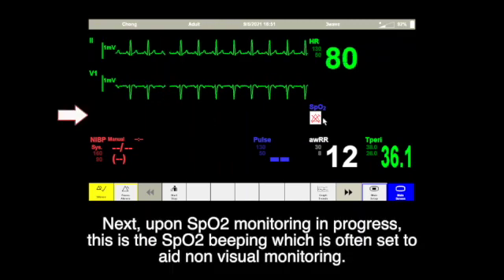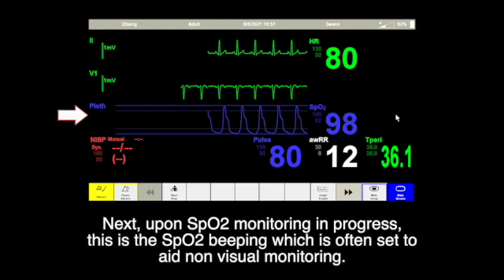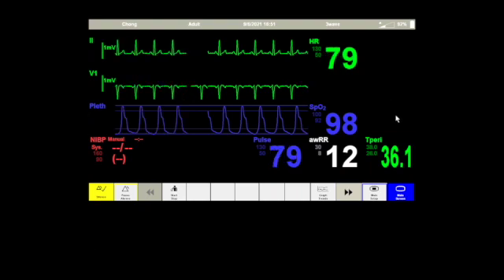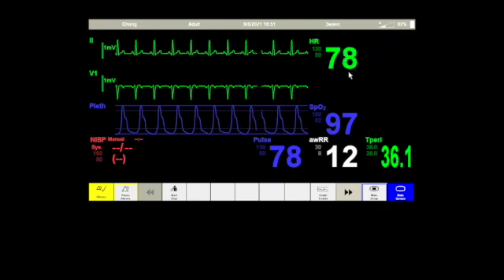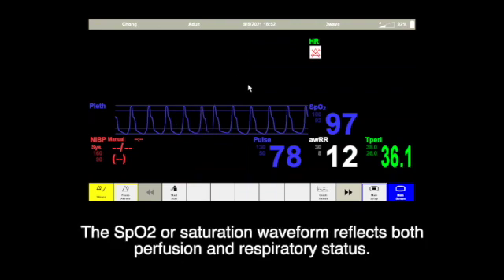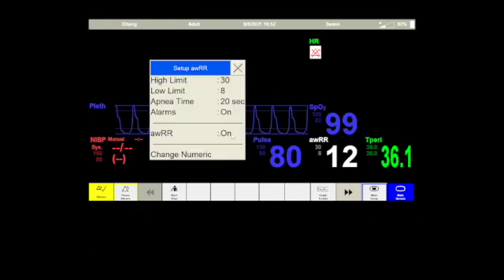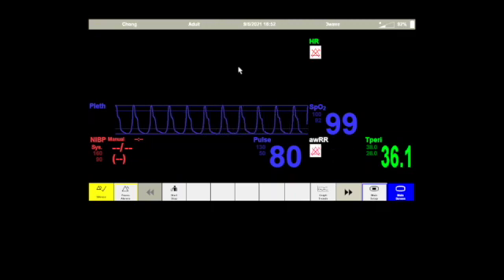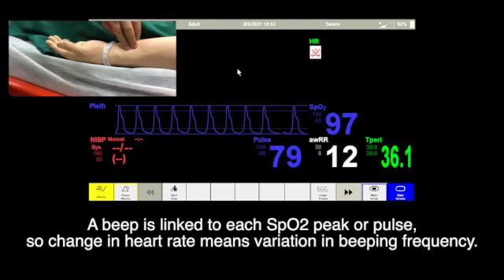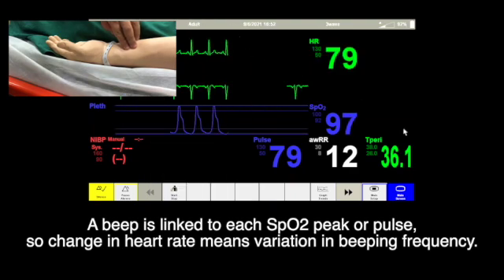Next, upon SPO2 monitoring in progress, this is the SPO2 beeping which is often set to aid non-visual monitoring. The SPO2 or saturation waveform reflects both perfusion and respiratory status. A pip is linked to each SPO2 peak or pulse, so a change in heart rate means variations in beeping frequency.